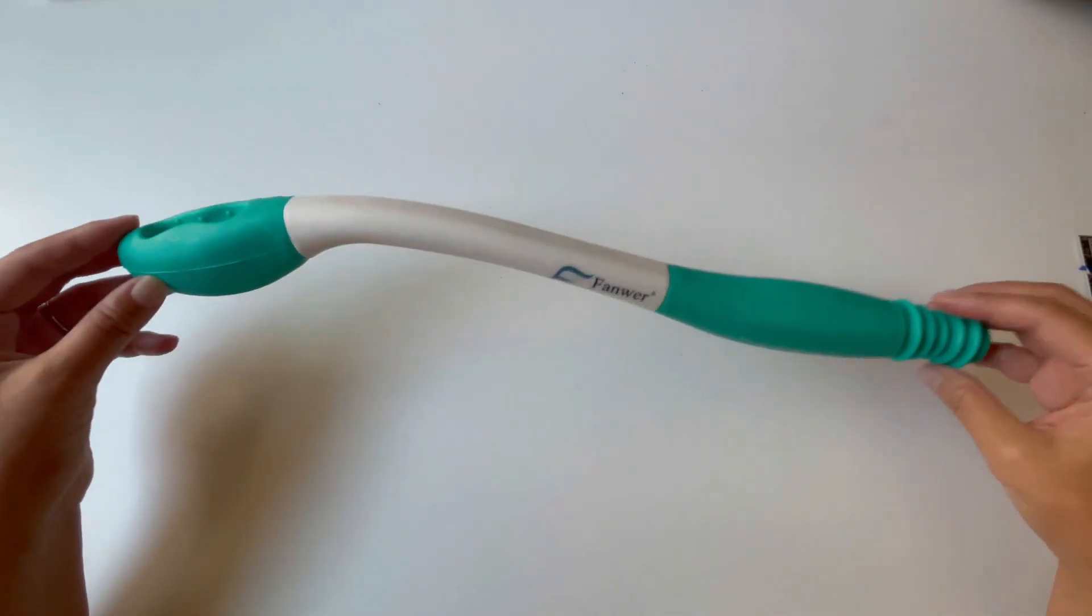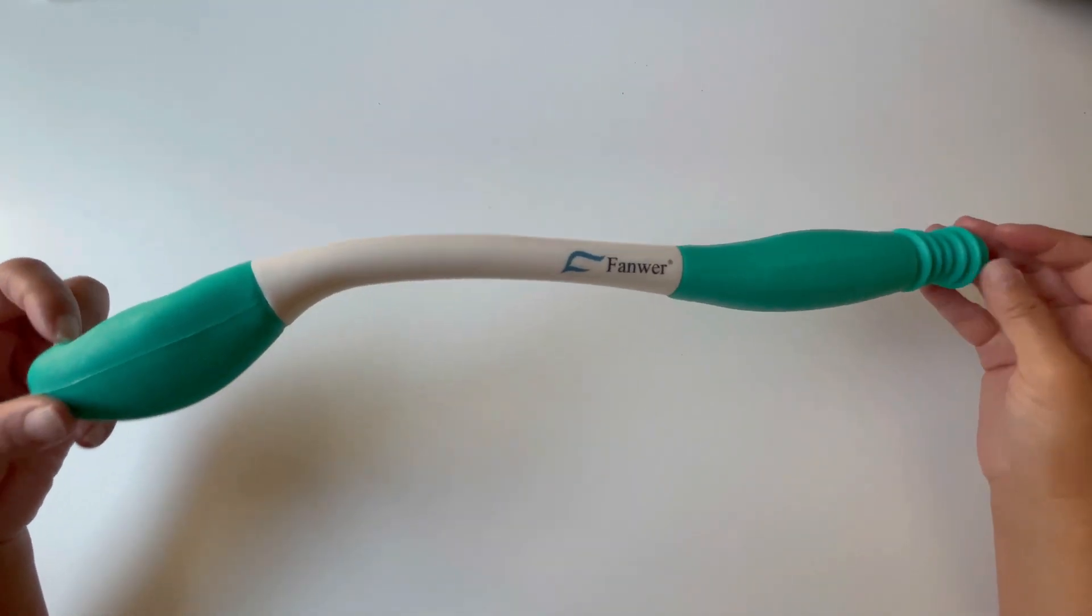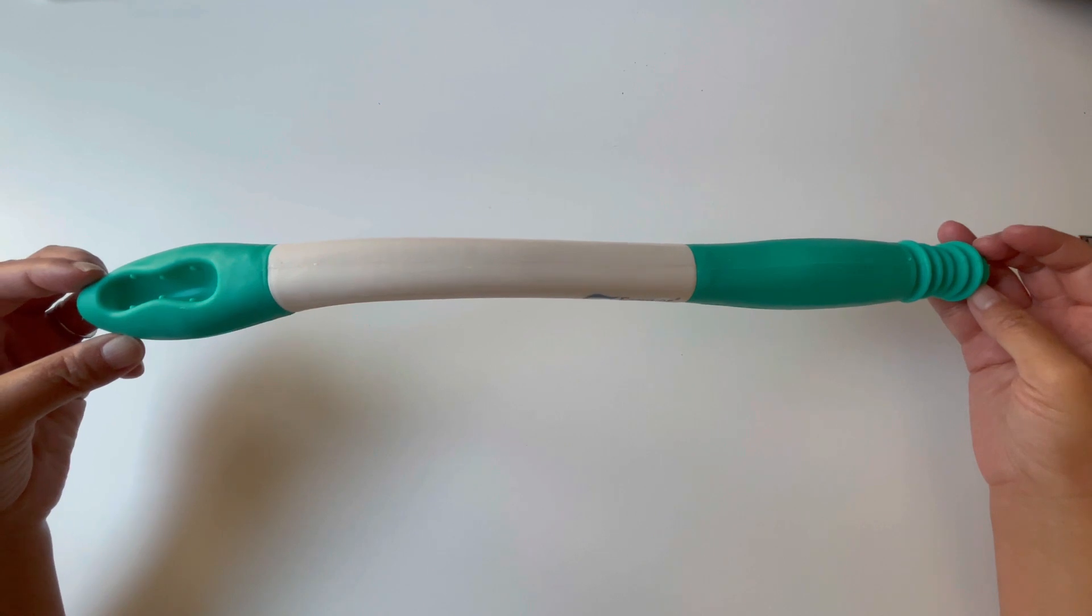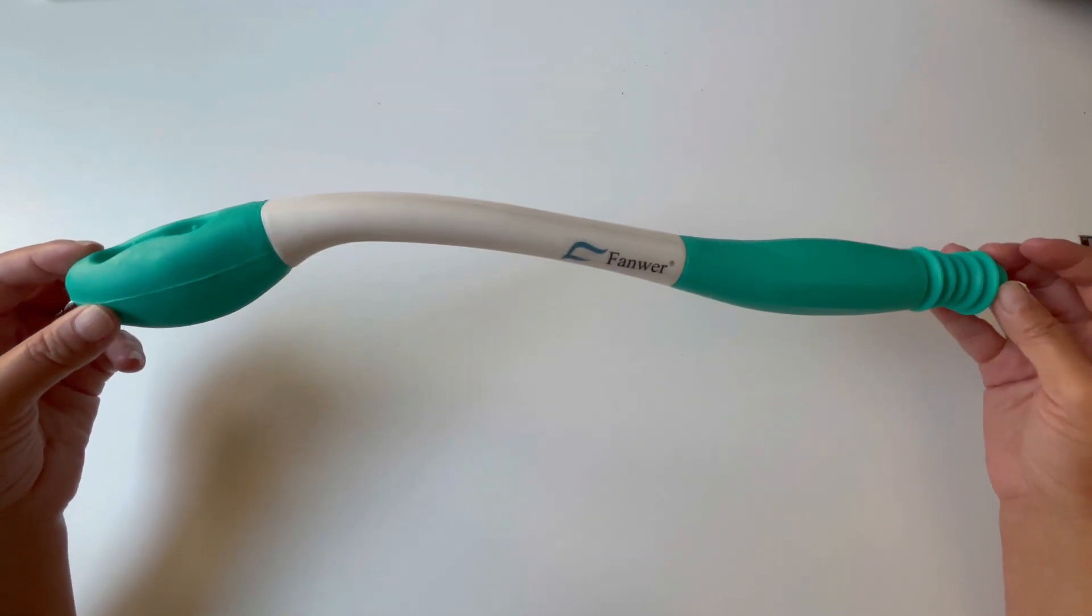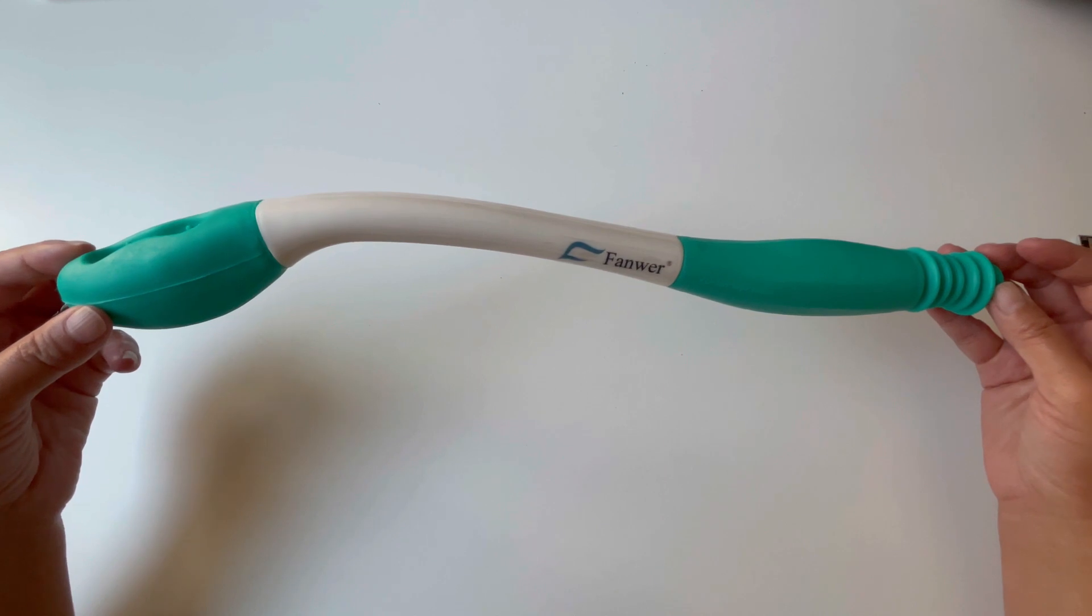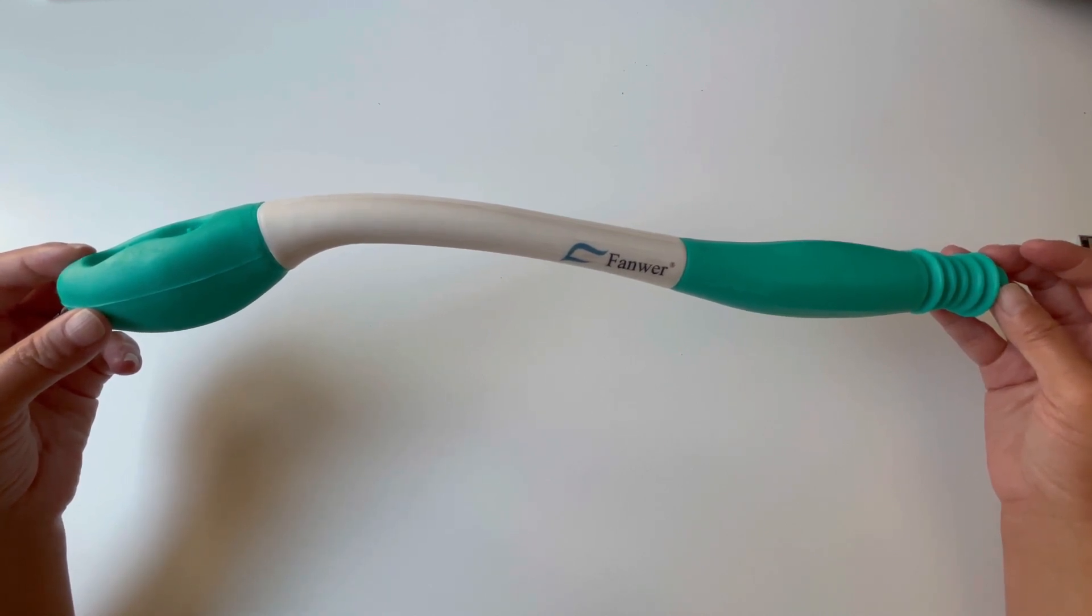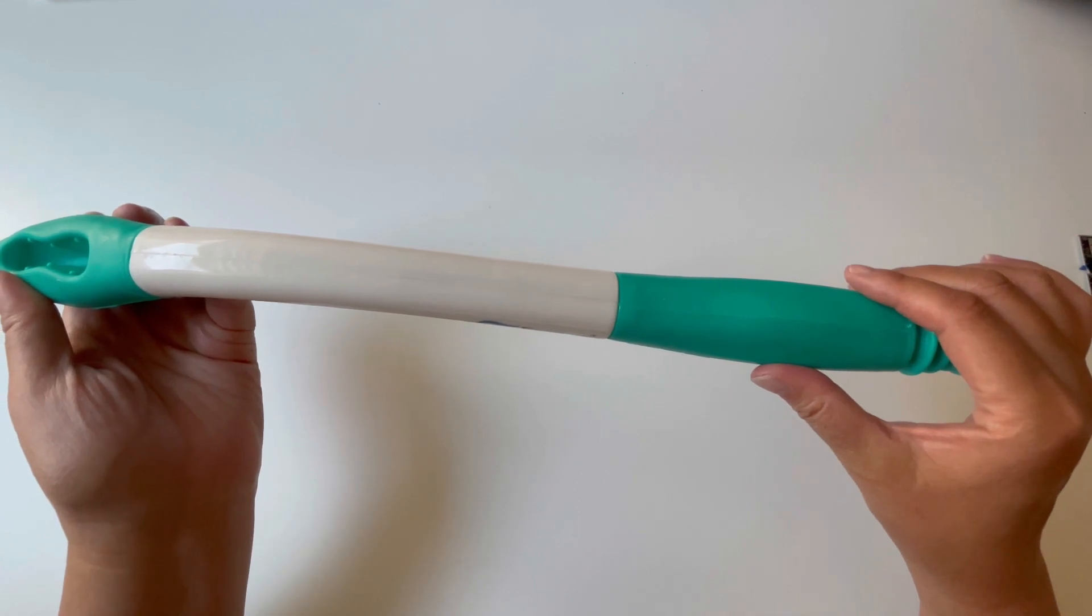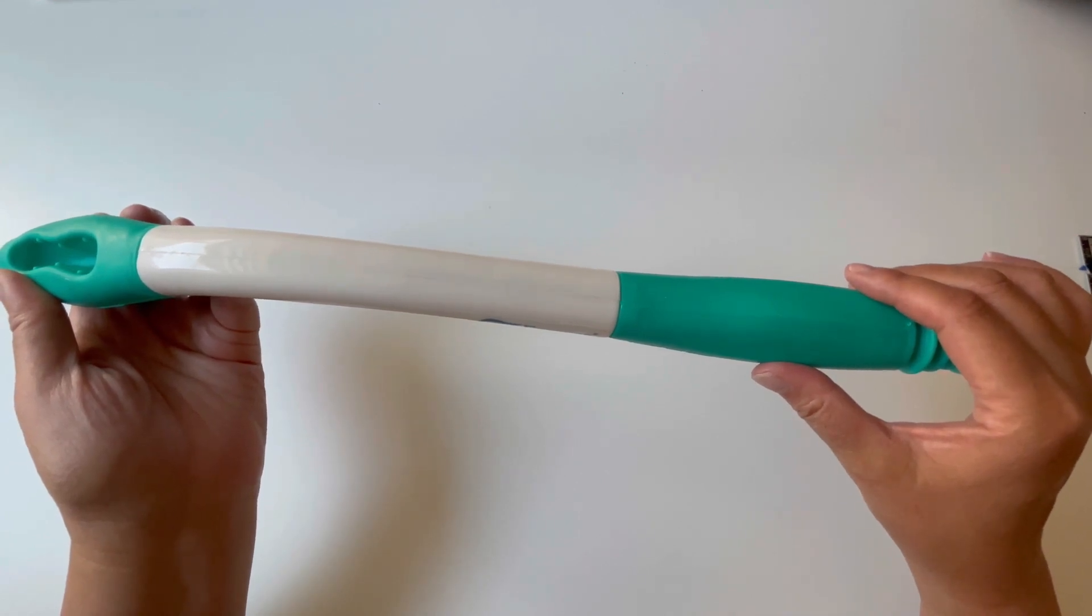Fawner has put a lot of thought into this. This is around 15 and a half inches long. It is made of plastic and the handle and the tip is made of a more tacky plastic.